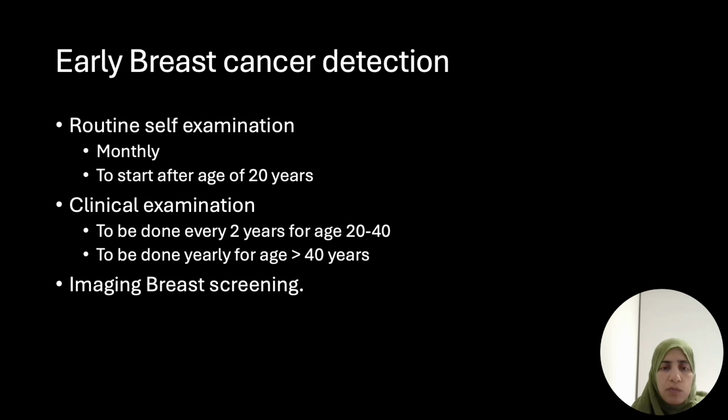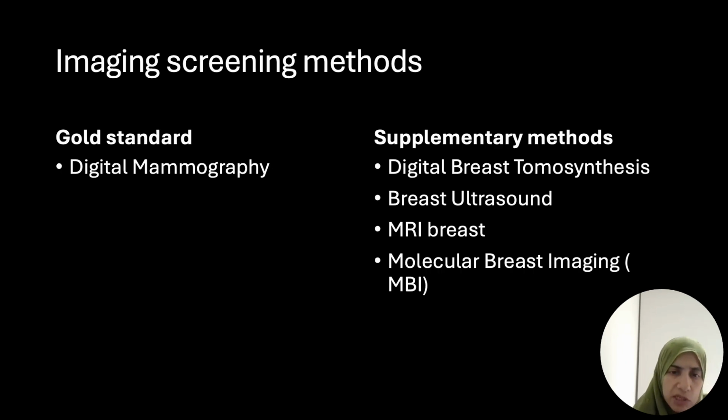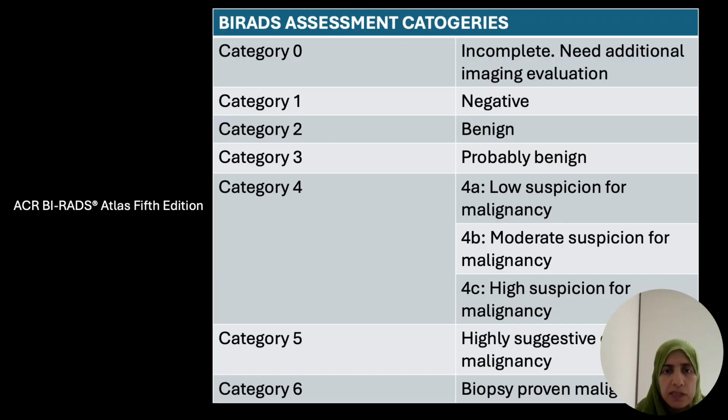And then most importantly is breast imaging screening. And the screening, as you all know, the gold standard method so far is digital mammography, which can be supplemented by digital breast tomosynthesis, breast ultrasound, MRI, and molecular breast imaging like PET-CT scan.